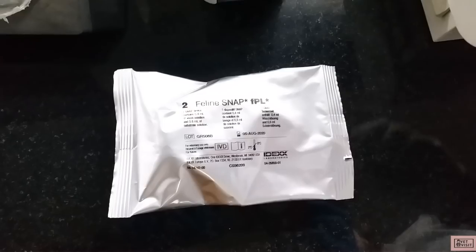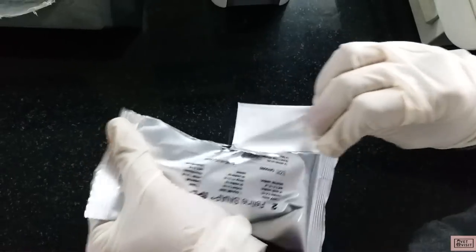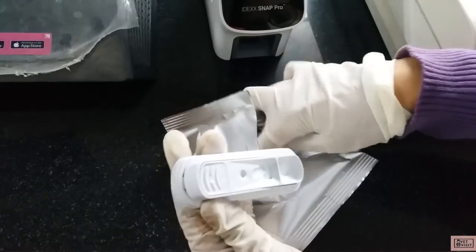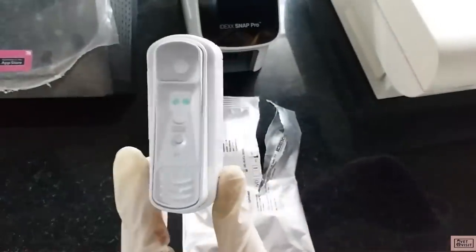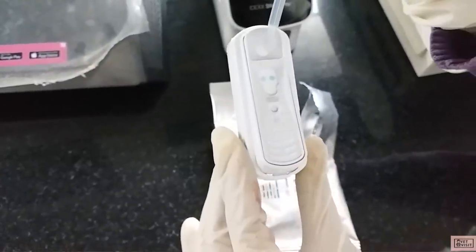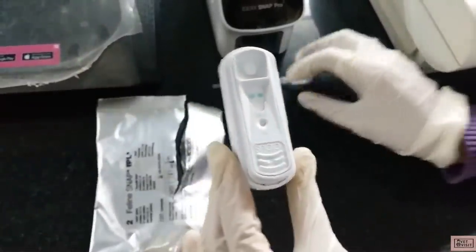Coming to the SNAP test. SNAP test kits are available for various diseases. Here is a testing kit of feline SNAP fPL, that is feline pancreas-specific lipase, and this test may be done when we suspect feline pancreatitis. We did not get any feline sample that day but I would like to show the kit and its procedure briefly. First we mix the conjugate mixture that comes in the kit with our blood sample in a sample tube. Then the entire conjugate-mixed blood sample is poured onto the sample well. Once the color first appears in the activation circle, we have to press the activator down or snap it — hence the name snap test.